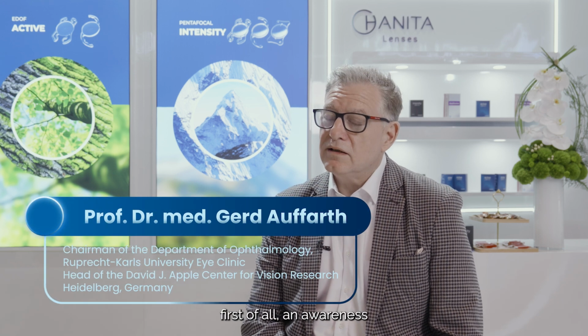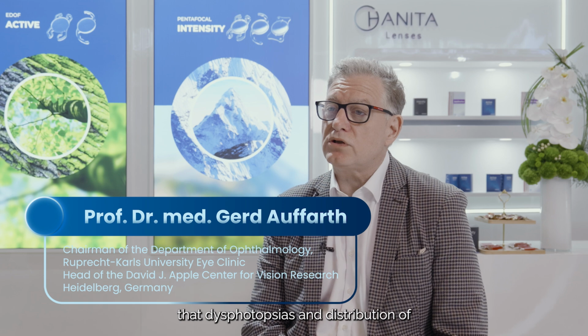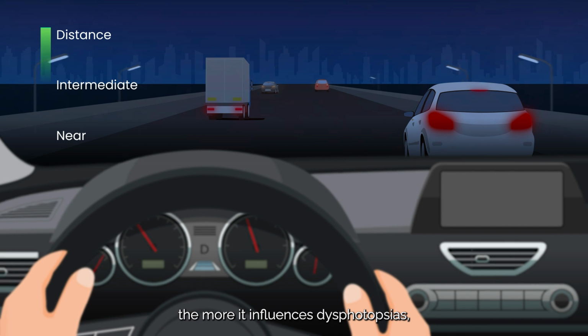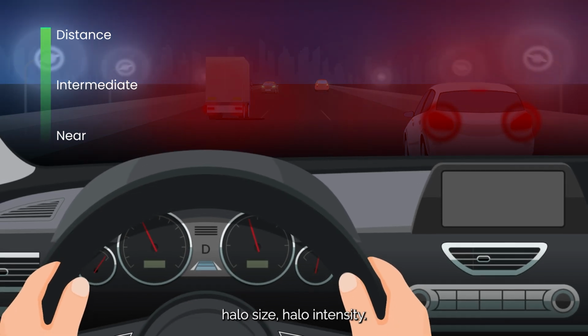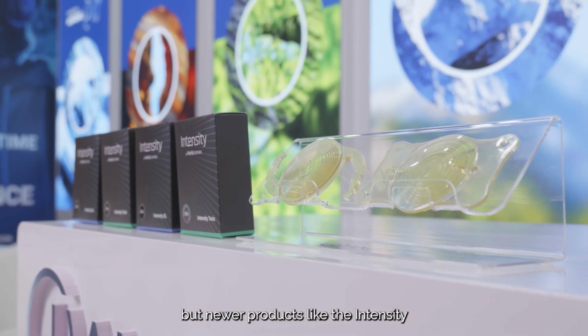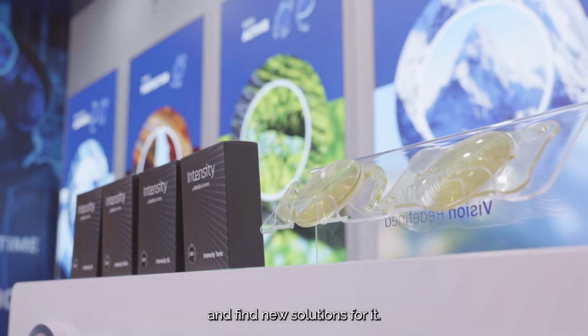We have seen over the last 10-15 years, first of all, an awareness that dysphotopsia and distribution of incoming light is a problem or is a topic. The more you extend the depth of focus, the more it influences dysphotopsia, halo size, halo intensity. You cannot get rid of that, but you can make it smaller, you can make it less intense by the way you distribute the light. So it has been addressed by all companies. Some of the older, long-standing products are still based on that technology, but newer products like the Intensity or other lenses on the market have adapted to that and find new solutions for it.